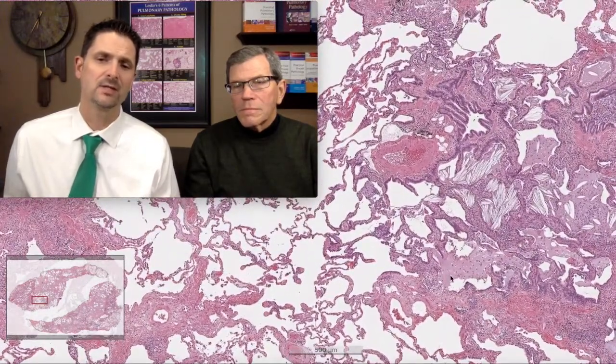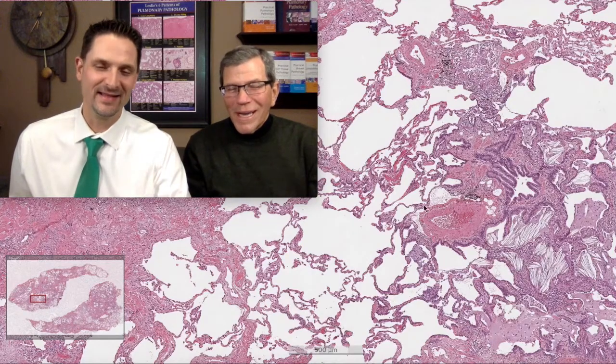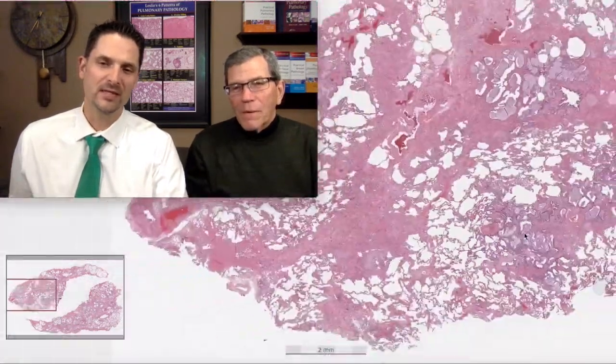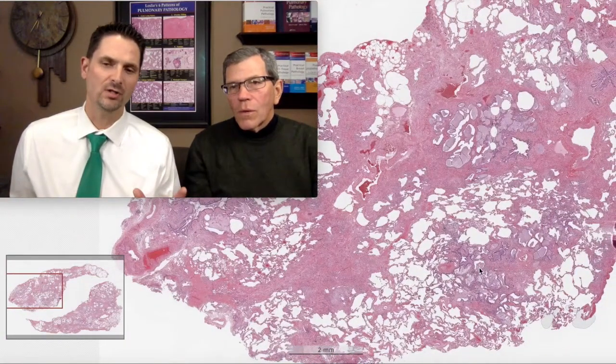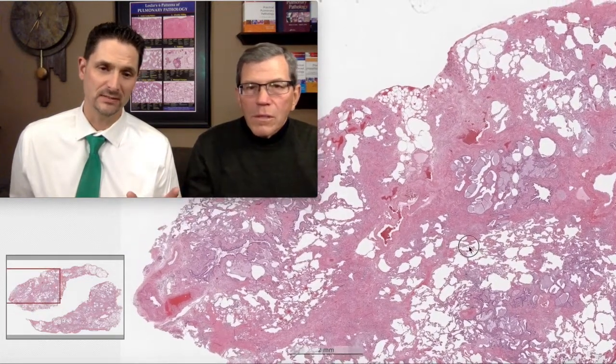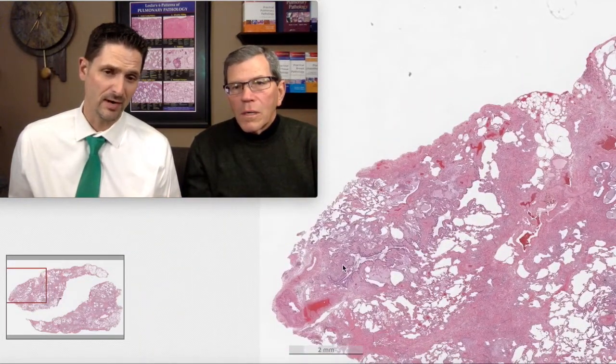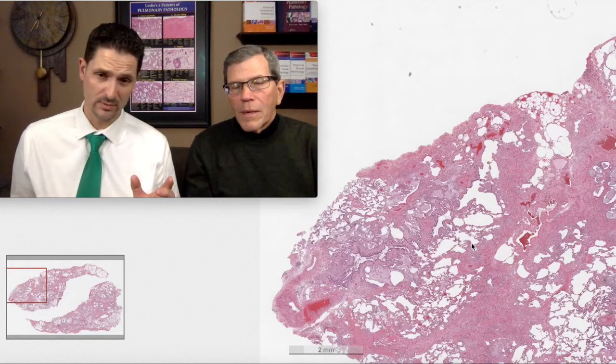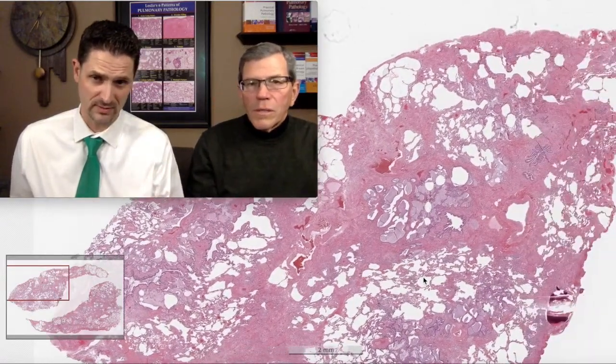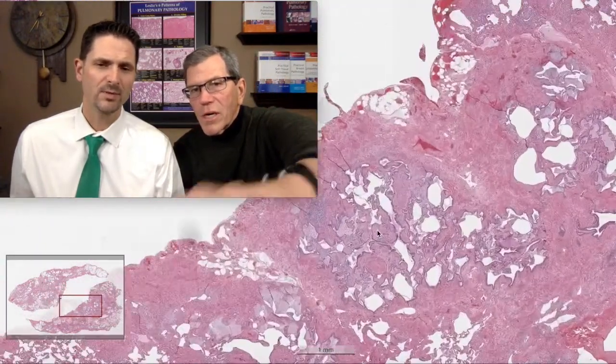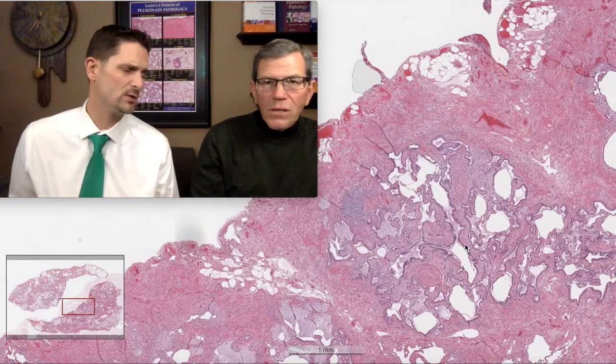There is peribronchiolar metaplasia, mucostasis, bronchioloectasia, and scarring. At higher power we can recognize there's active fibroplasia within these areas and abundant peribronchiolar metaplasia. This is the donut hole of fibrosis — it's no longer a hole, it's a dense fibrotic center with the artery right there. When I see something like this I say: this is strongly suspicious for an airway-centered fibrosing process. Some of these lobules are end-stage and you can't distinguish whether fibrosis started inside or outside.